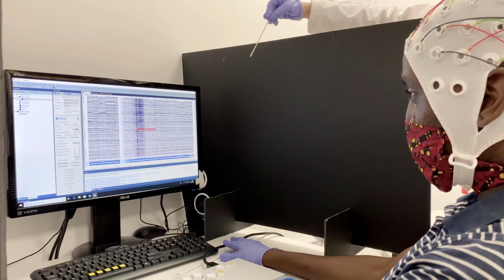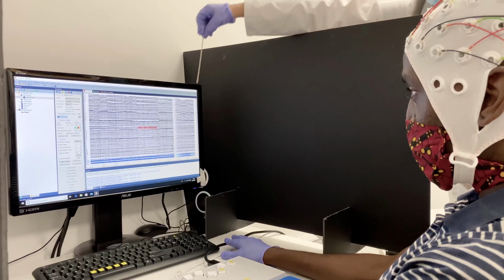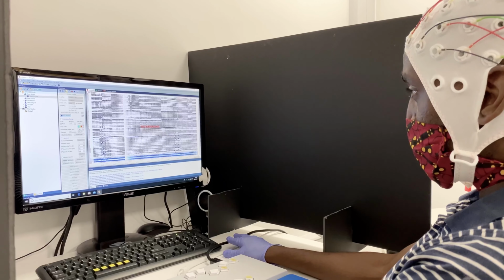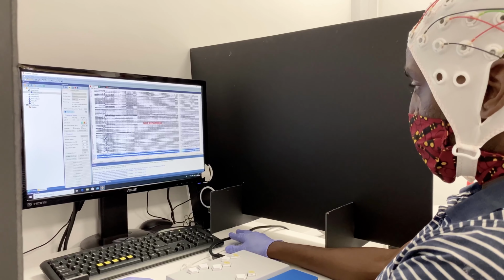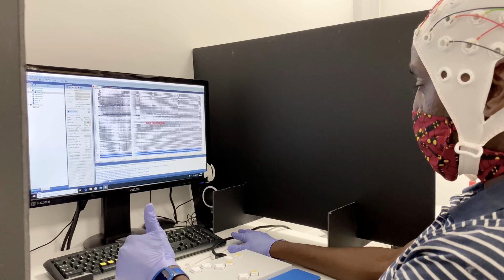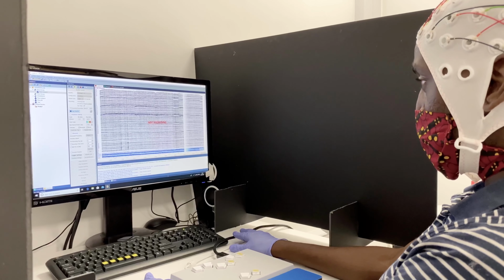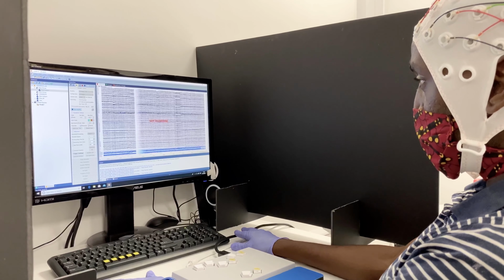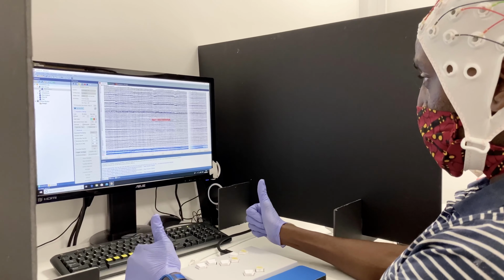Can you please look to the left and to the right, just with the eyes? Exactly. Do you see that? These are artifacts when you do not look to the middle of the screen. During the experiment, we will show you a fixation cross, and you should look exactly to the middle, okay? Perfect. And can you move your head a little bit for me? Just a little bit. You see? The signal is getting a little bit noisy again. So really try to calm down and relax. Perfect.